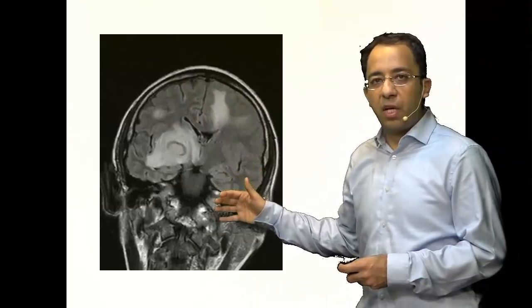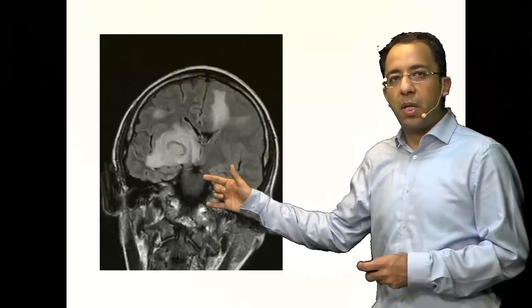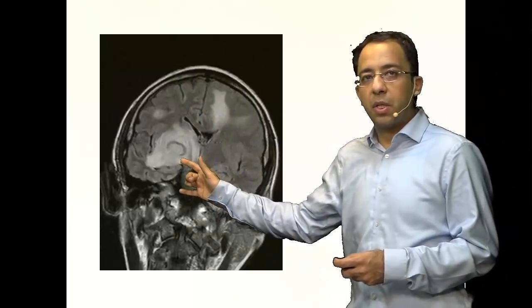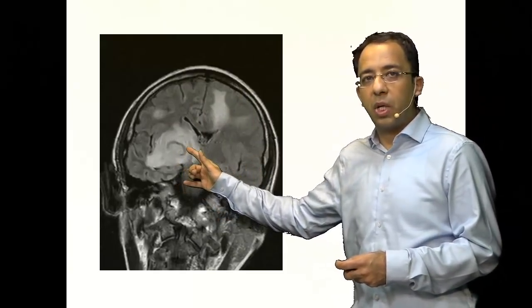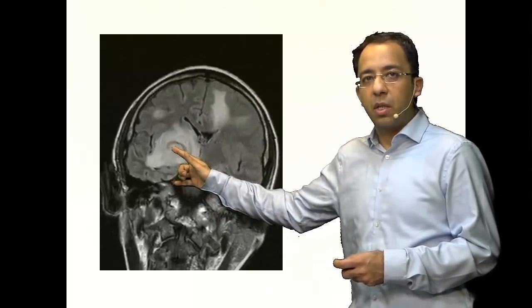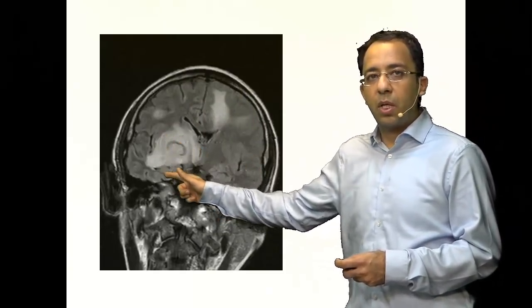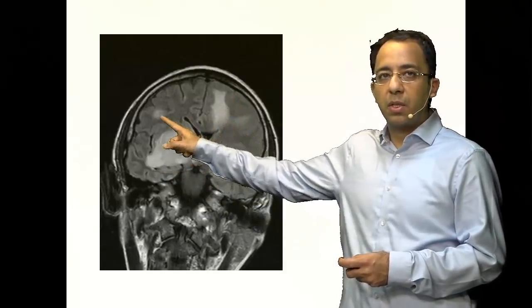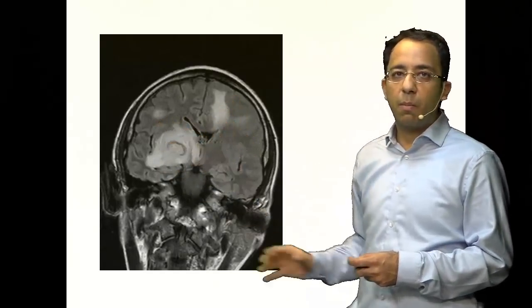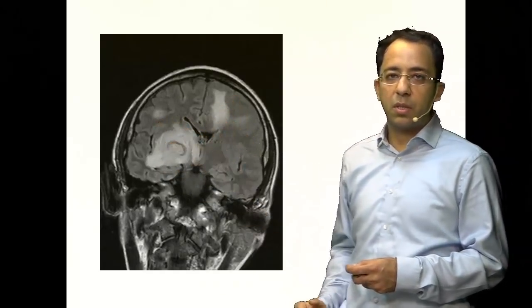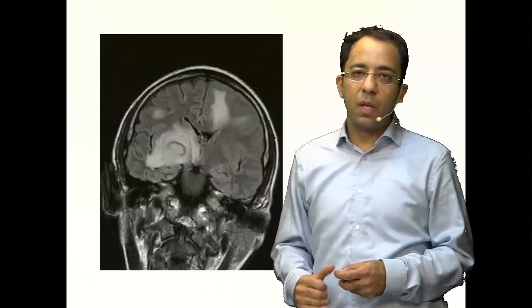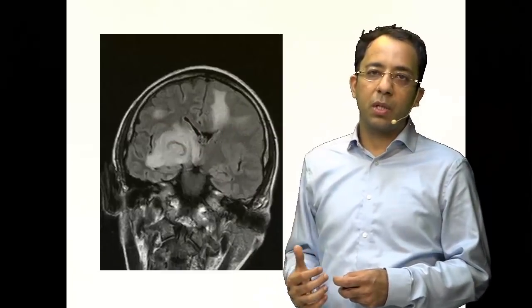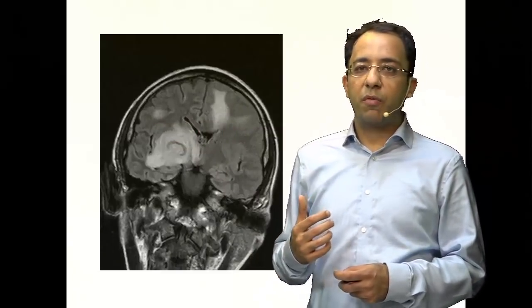In the FLAIR image you can delineate the same ring lesion with surrounding edema in the basal ganglia area. At the gray-white matter junctions you can see multifocal lesions. At this point, we need to give contrast.